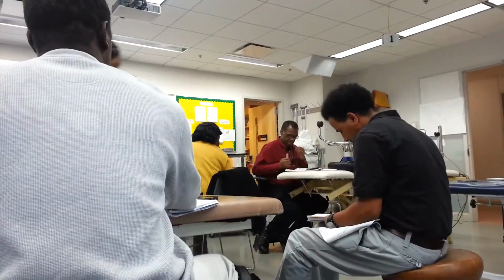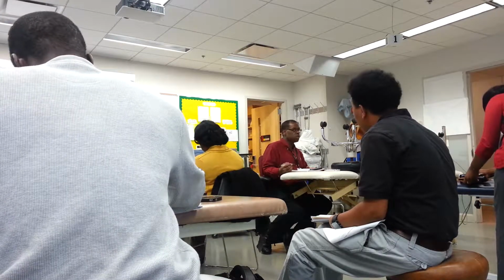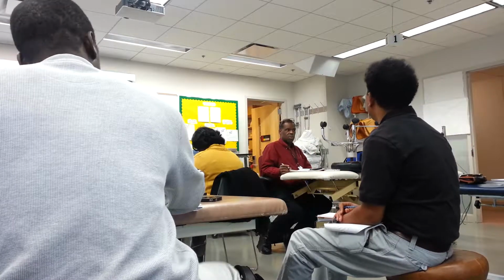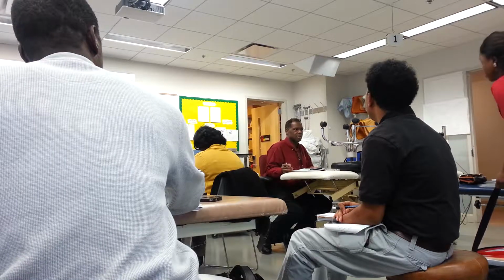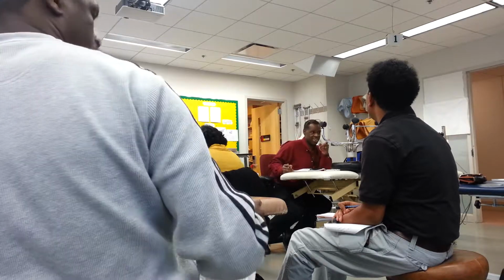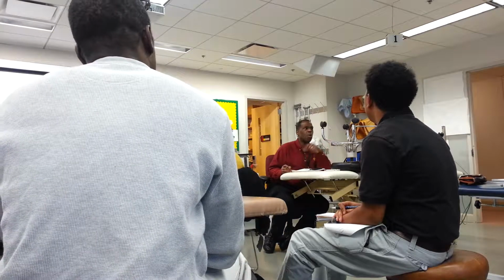Overview. Monophasic. Mono means one. Phasic is referring to the charge that's in the machine. So a monophasic machine has what going on in it? Monophasic talks about the machine has what in it? Polarity. So monophasic is talking about polarity, positive or negative.